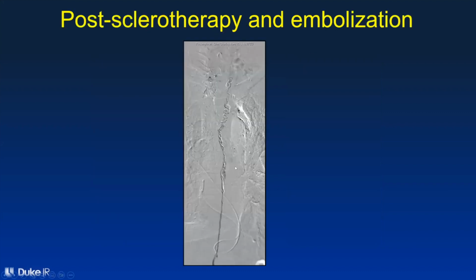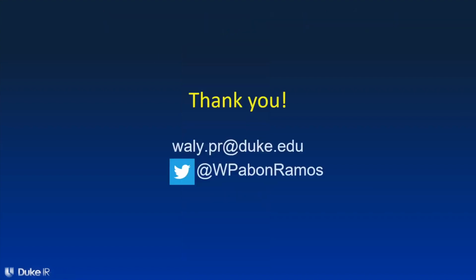So what we did is we got into that abnormality. We treated it as we traditionally treat lymphatic malformations, which is by injecting a medication called a sclerosant, which basically ablates the inner lining of those abnormal lymphatic vessels. And then we embolize the thoracic duct, as we usually do, and the chylopericardium resolved.